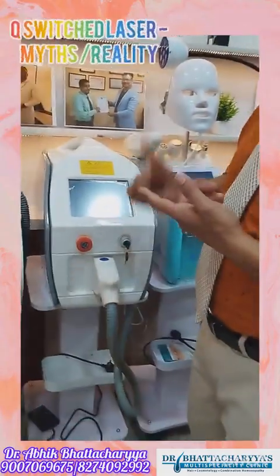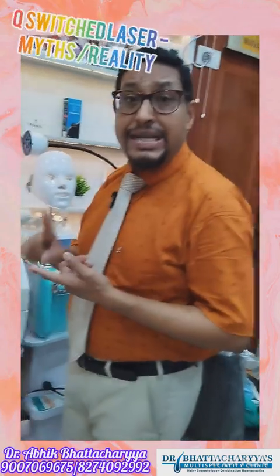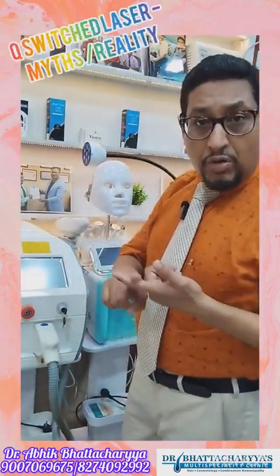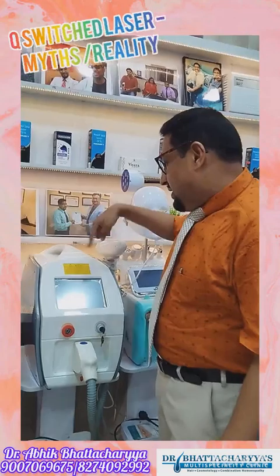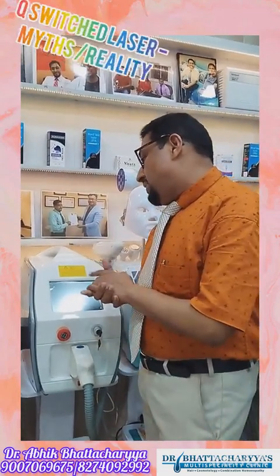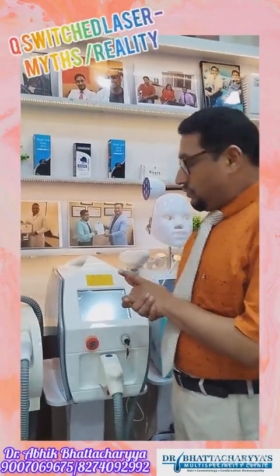The full form is Q switched Nd:YAG laser. The technology is termed as Nd:YAG. It is Q switched Nd:YAG laser. So this is the machine. Now, what does the machine exactly do?